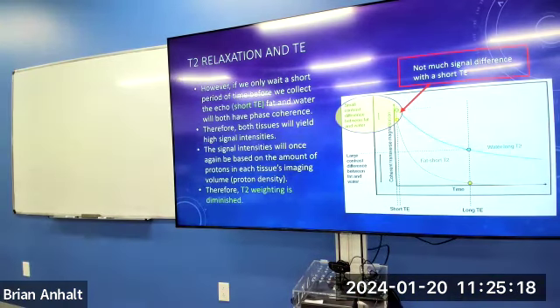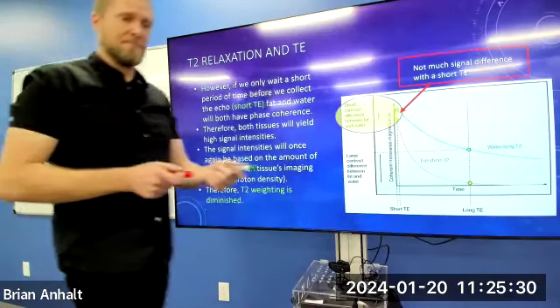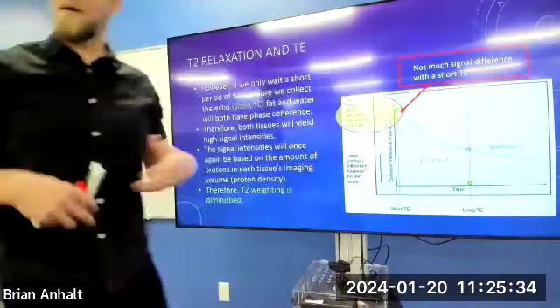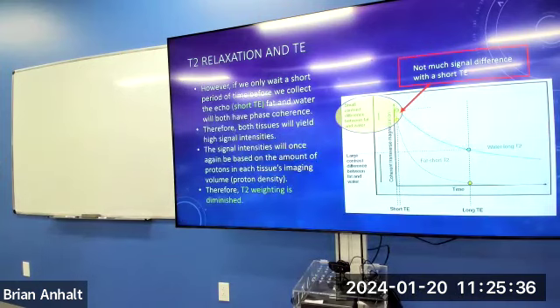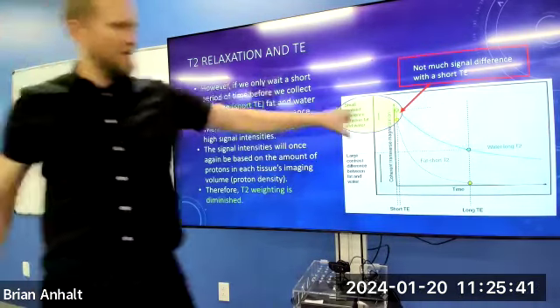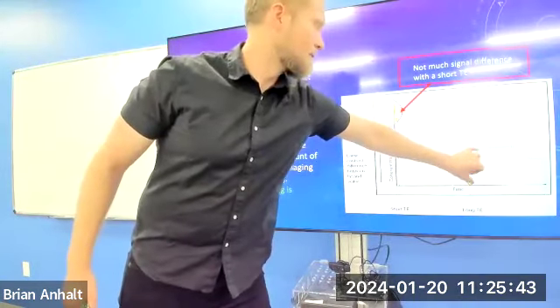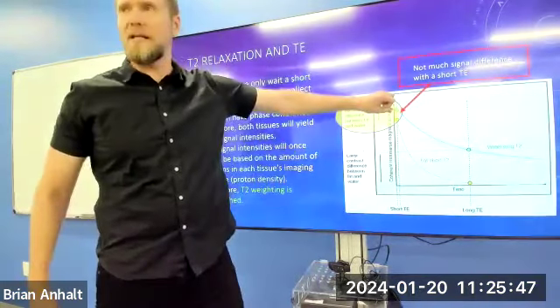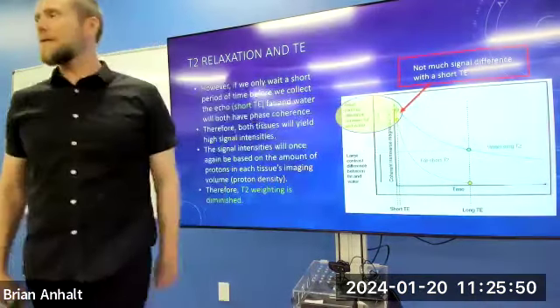Back here wasn't the time to get T2 contrast. We get a lot of signal, but no contrast, right? Based on T2 decay. Wait, we get good contrast right here. If we keep waiting, this goes away too, right? If we wait too long, the contrast goes away as well. All signal goes away. And we end up with nothing. But there is a window there. We want a relatively long TE to get better T2 information. Very short TE is minimizing that T2 contrast.